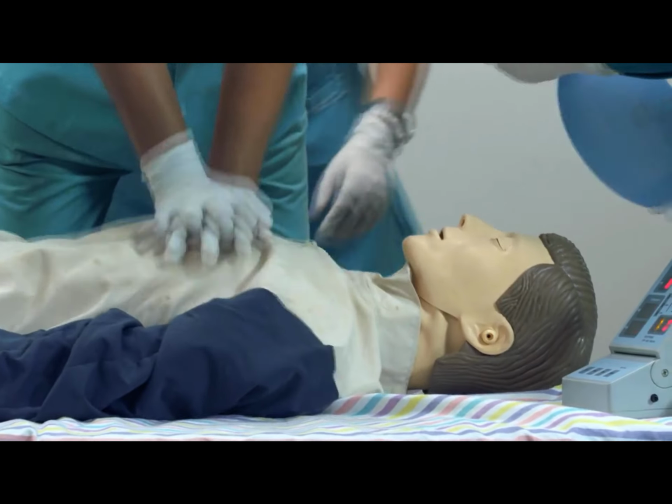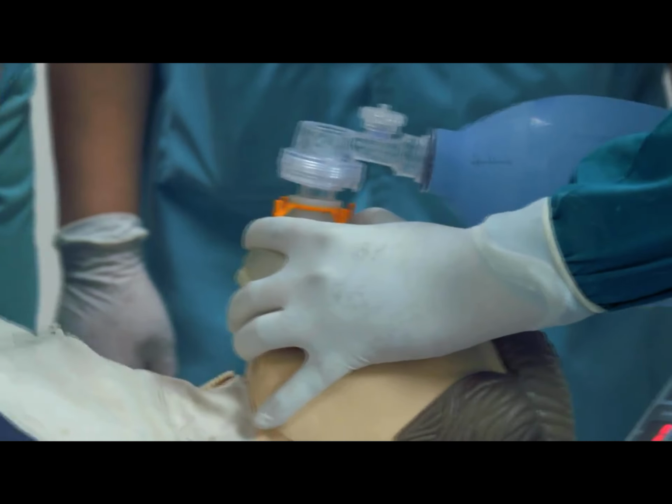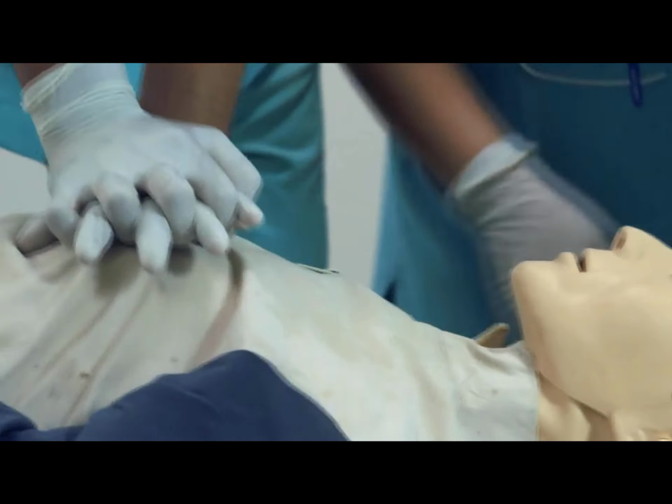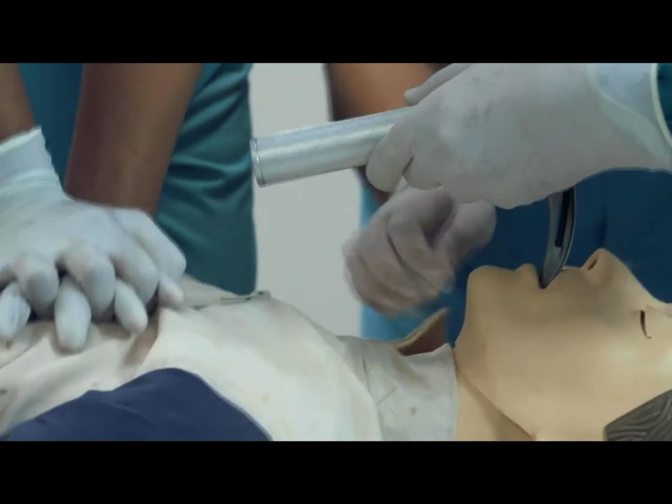Overview: Obtaining venous access in critically ill children as well as in adults is an essential procedure to restore blood volume and to administer drugs during pediatric and other emergencies.